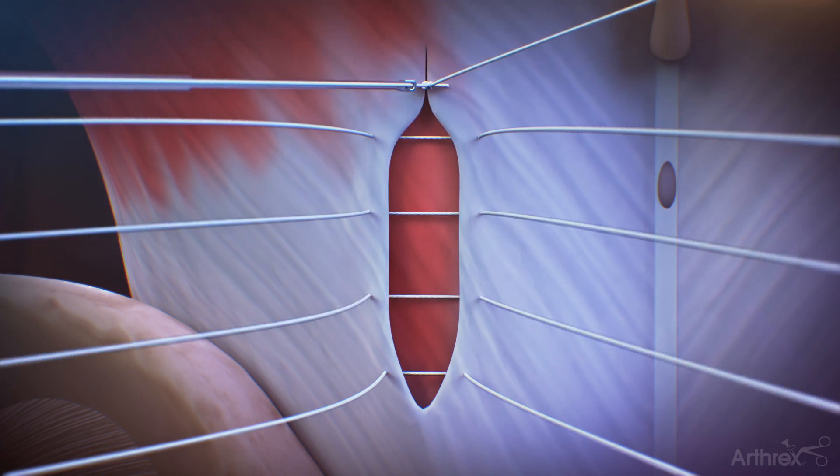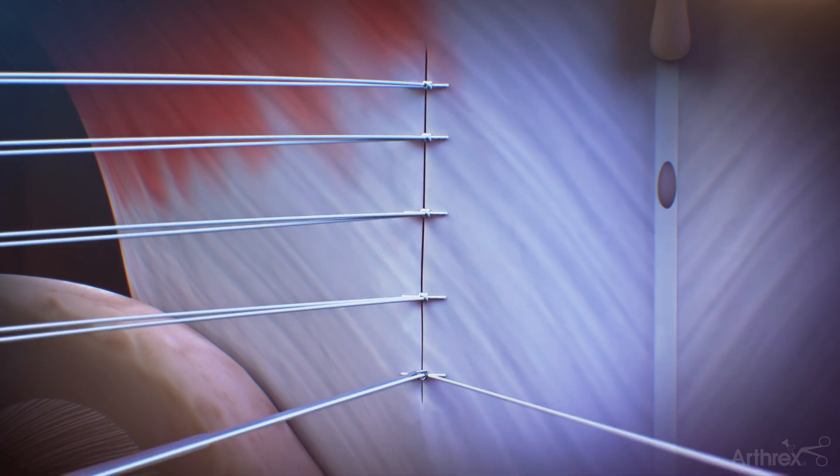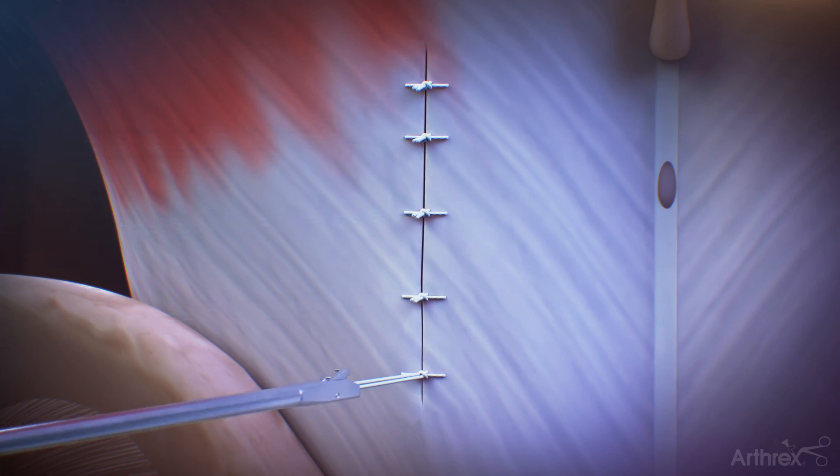Depending on the depth of the incision, a knot pusher may be required to appropriately tie the knots and secure the suture. Additionally, a suture cutter may be required beyond a certain depth to properly cut the suture. It is recommended that a tail between 2 to 4 millimeters be left after cutting.